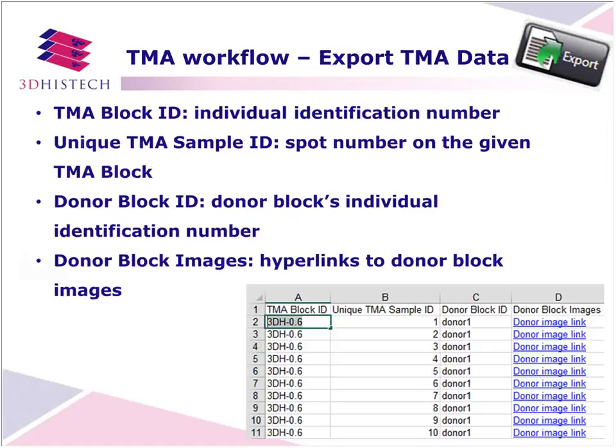At the end of the TMA project, you can click the Export button and export the TMA data. If you forget to export the TMA data after finishing your project, there is no problem, because everything is saved to the TMA database. So you can load a TMA project later and do the export process later if needed.